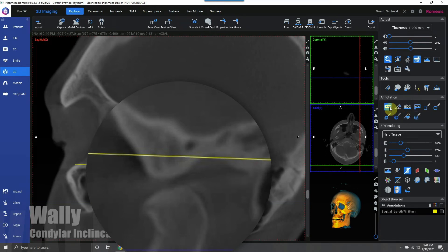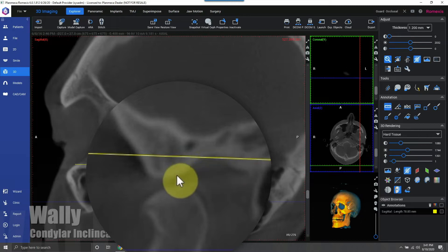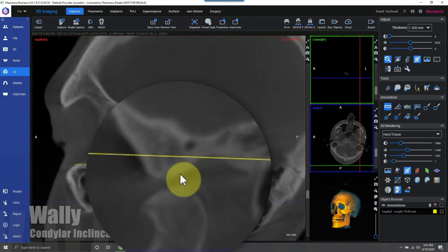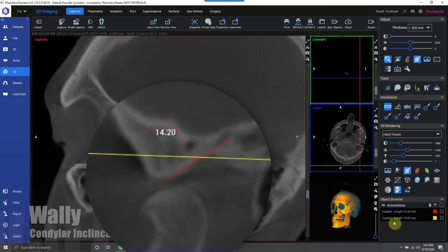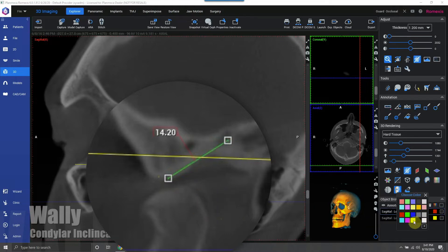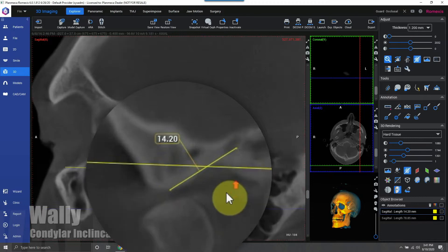Now I'm going to focus in on the condyle, the glenoid fossa, and articular eminence. I'm going to drop another line from the crest of the articular eminence to the crest of the glenoid fossa, right about midpoint of the condyle in the slice view.